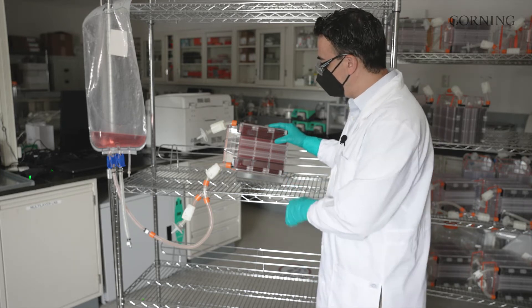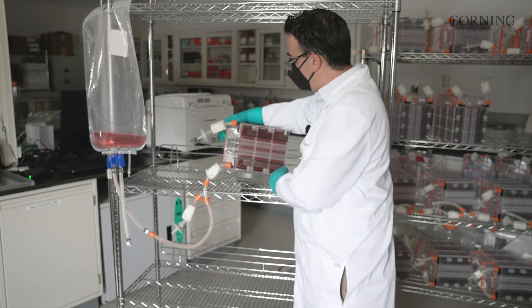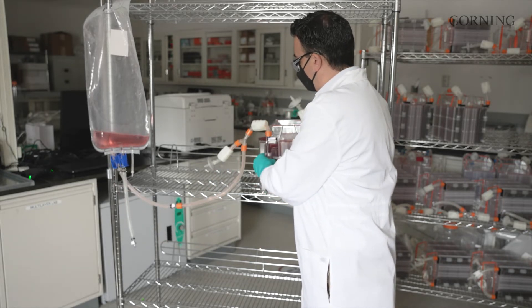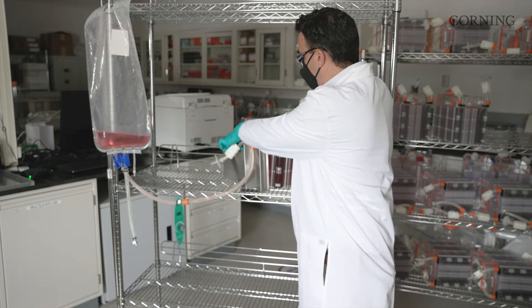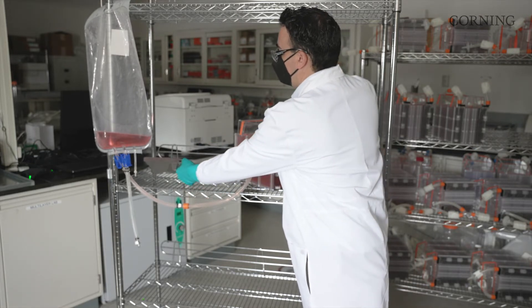In order to do that, the first thing we're going to start with is removing the Nest stainless steel accessory. To do that, we're going to grab the top tray, we're going to pivot, stand the HyperStack up. We're then going to lift again using the top tray just gently to remove the registration tabs from the Nest. We can then set that off to the side.